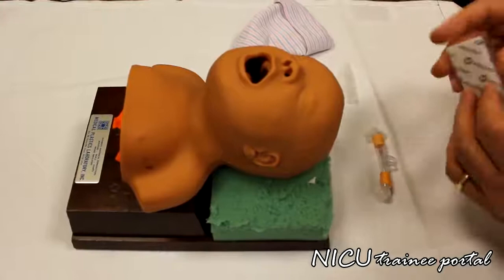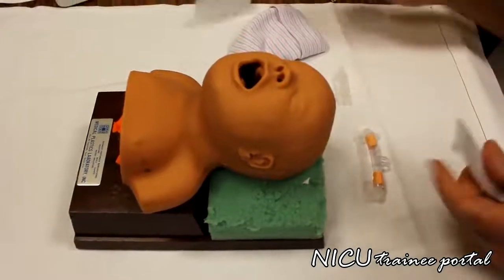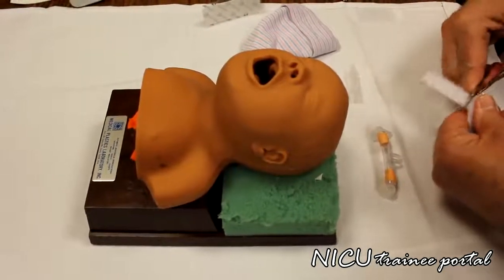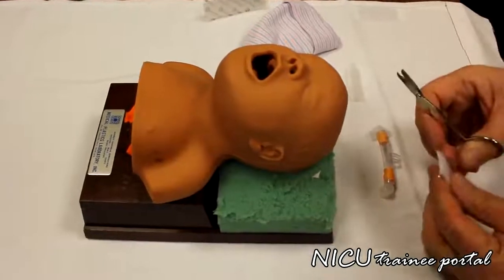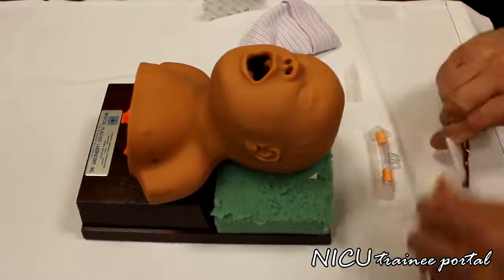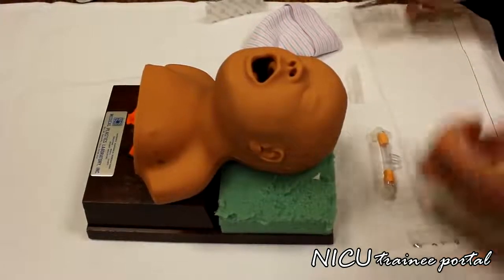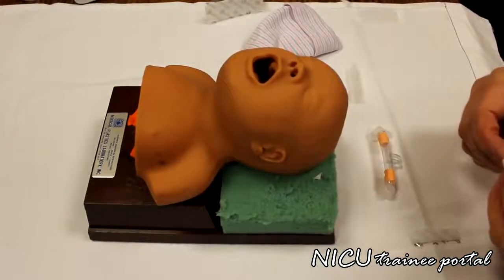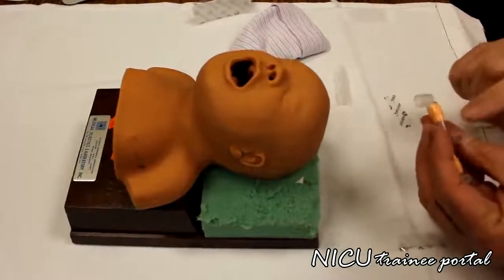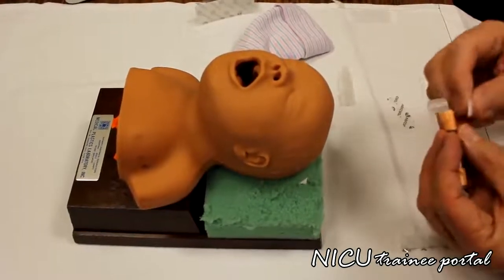Then we cut the smooth side of the Velcro, not the looped side, the smooth side. And then we cut like a 1/2 inch strip for each side. And then we apply. Typically I like the seam at the top that runs parallel with the prongs, you'll see.